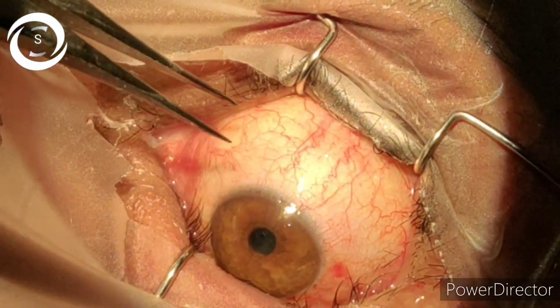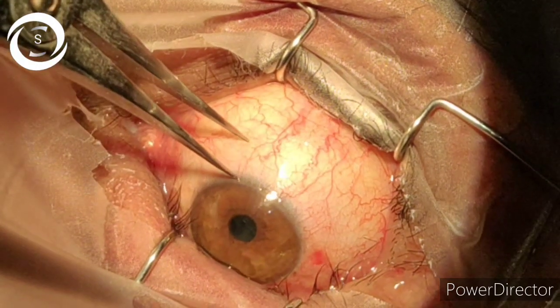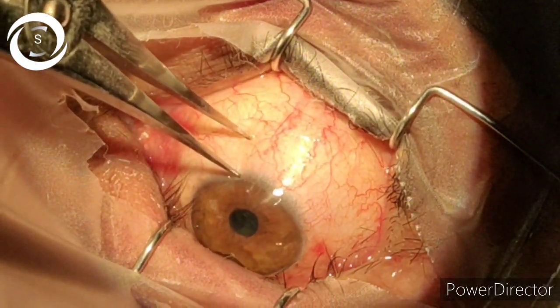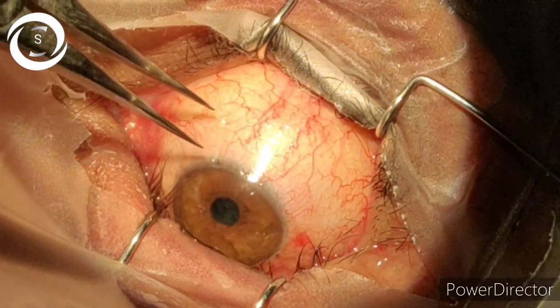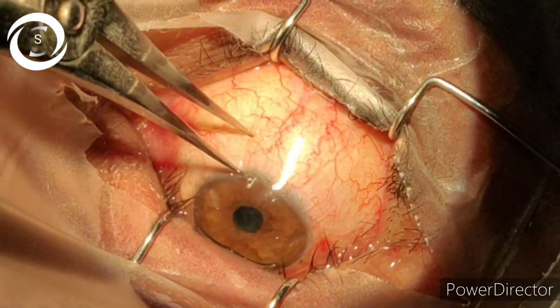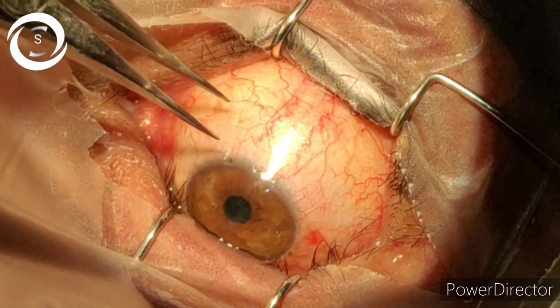And then put 0.05 ml intravitreally with the needle pointing to the center of the vitreous, and don't come out of the globe immediately. Take 5 to 10 seconds. You can squeeze the conjunctiva around the needle with a suture tire to stop the vitreous reflux.